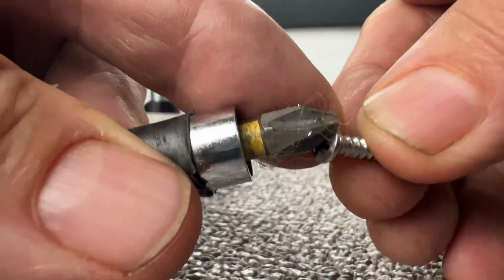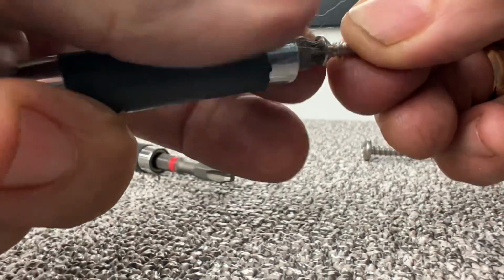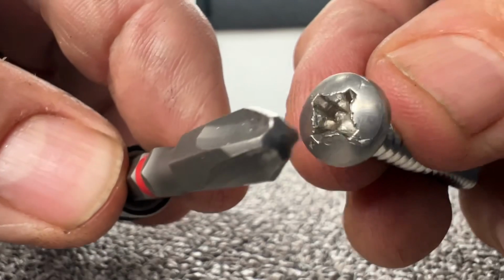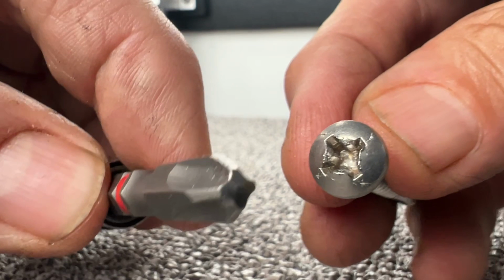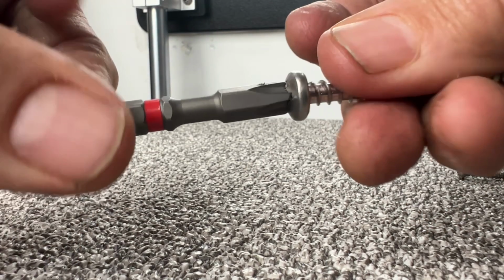As you can see, the standard screwdriver works great for typical Phillips screws. But when it comes to these bearings, we're using a number 3 Phillips. As you can see, this particular bit will fit very snugly and completely fill up all of the gaps in this Phillips screw head, and you're not as likely to strip it.